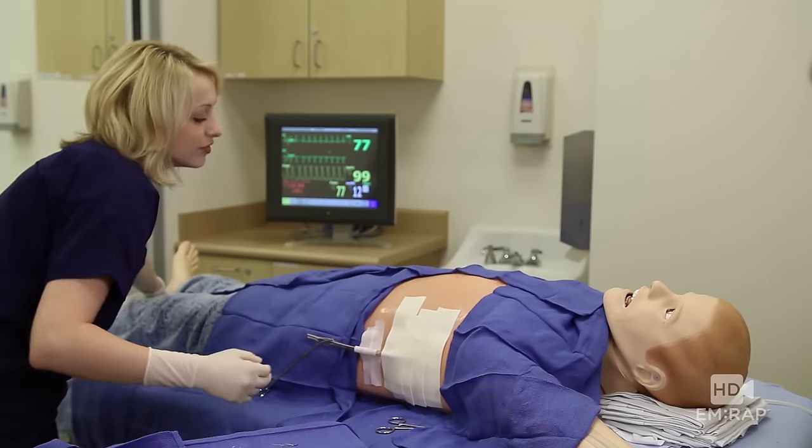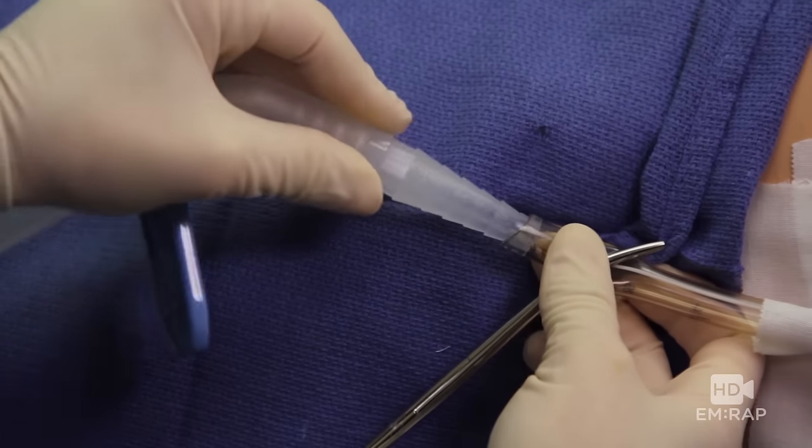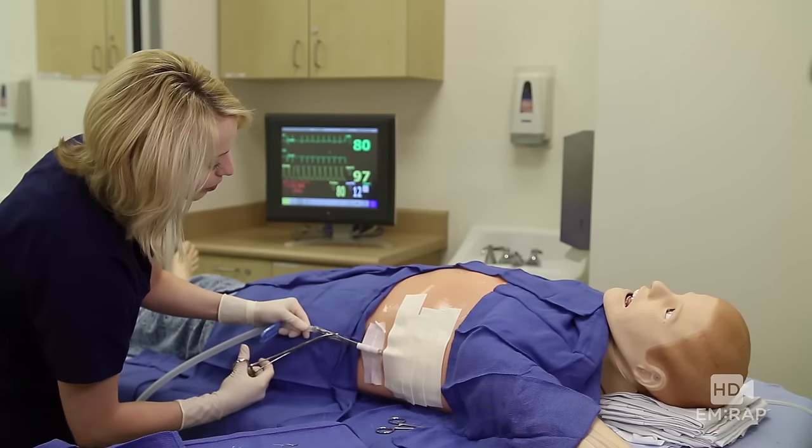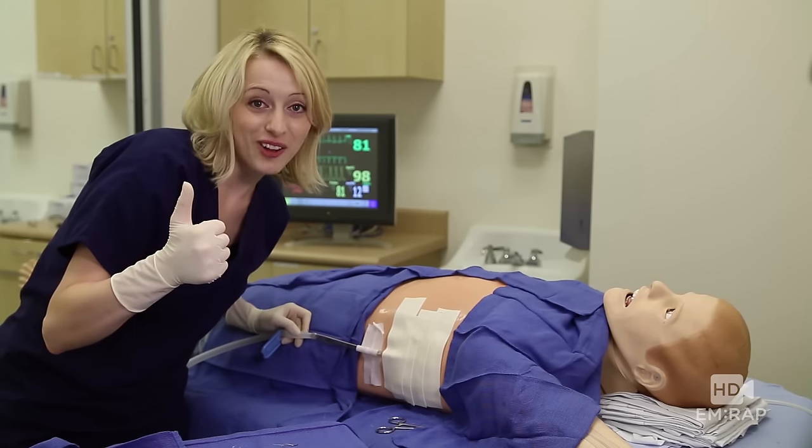Now connect your chest drain — gracefully cut the end off, connect your tubing, and remove the clamp. Get your x-ray and you're all done.